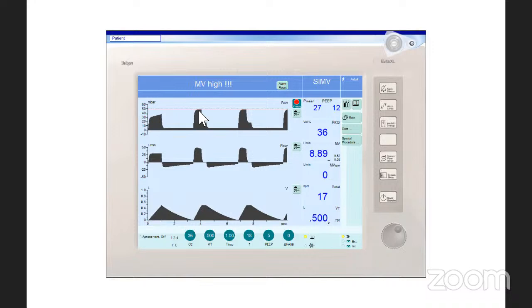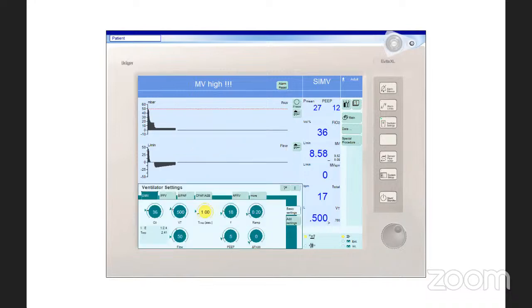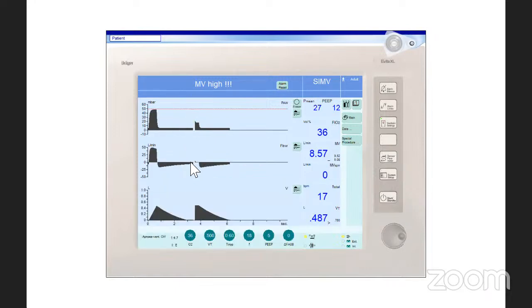But as we increase the flow, we were able to deliver the volume faster. But since we did not change the inspiratory time, all what we gained is the plateau time again. So what we need to do is to go down on the inspiratory time and confirm, so we get rid of the plateau time again. You can see that we improved the auto-PEEP remarkably. However, it's not completely resolved.